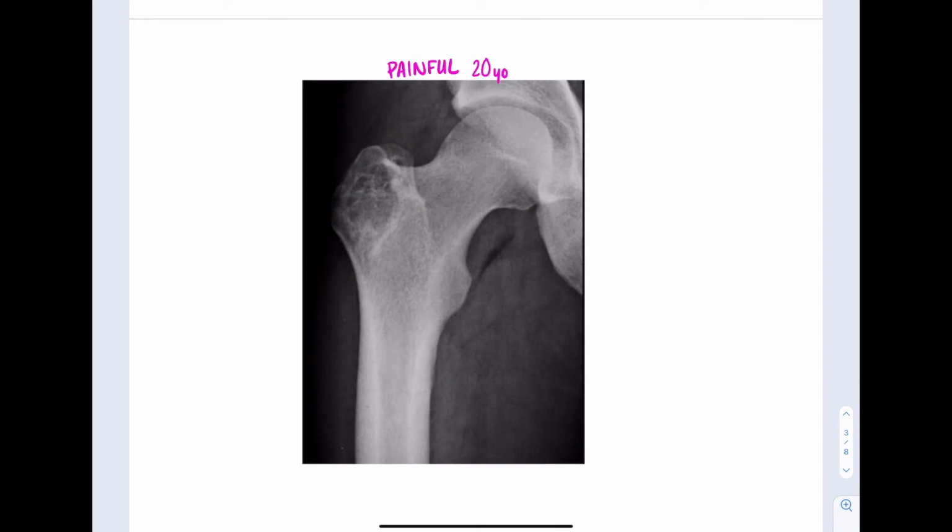What is our differential? Okay, so let's get our list out. So painful list. So it's Fegnomashic. So fibrous dysplasia, GCT, osteoblastoma. Our M stands for plasmacytoma, and our blowout Mets, aneurysmal bone cyst, chondroblastoma.